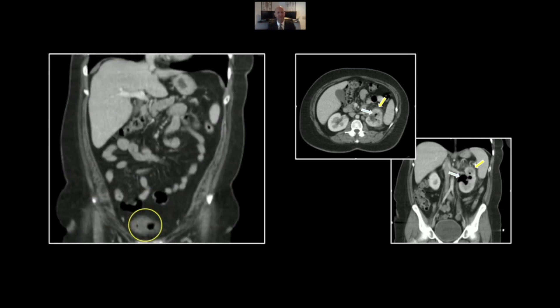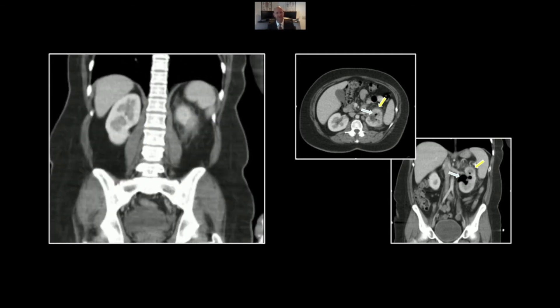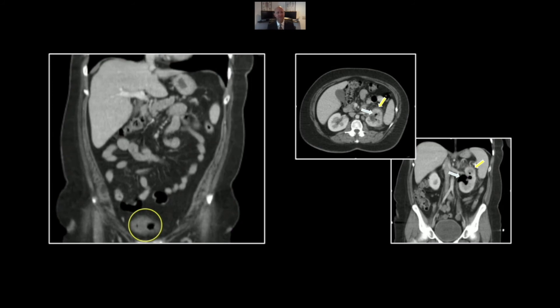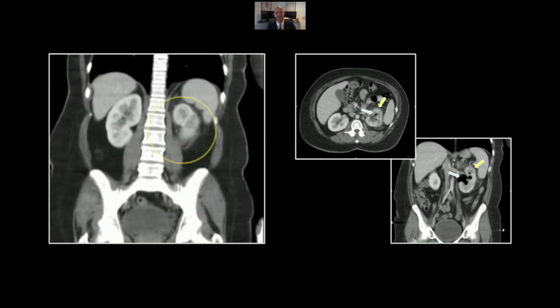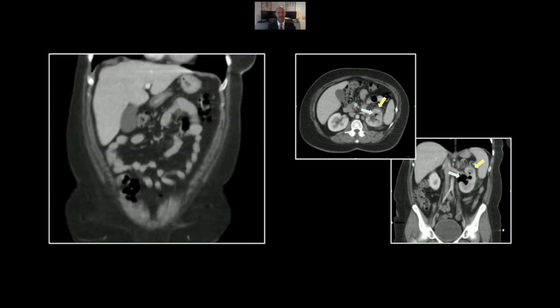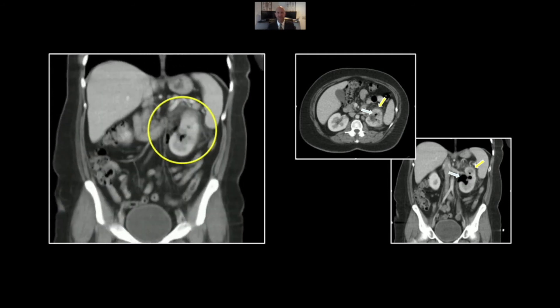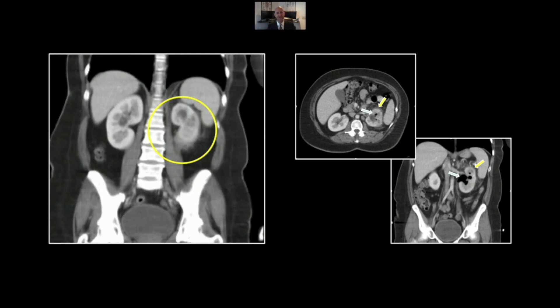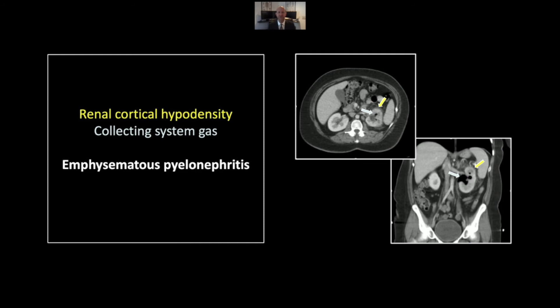On the coronals, you can also appreciate a little gas within the bladder, a common finding associated with emphysematous pyelonephritis. Isolated gas within the bladder — emphysematous cystitis — is less concerning, more easily survived, and not restricted to the diabetic patient population. But in this setting with emphysematous pyelonephritis, that is clearly not the primary pathology. That is a case of emphysematous pyelonephritis.